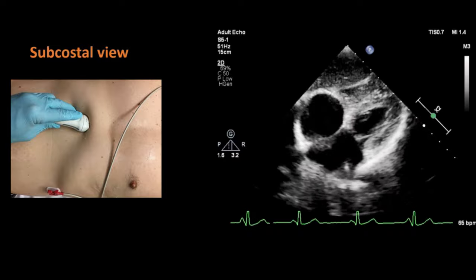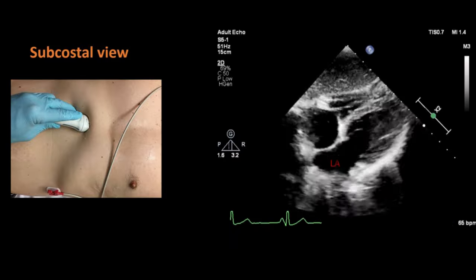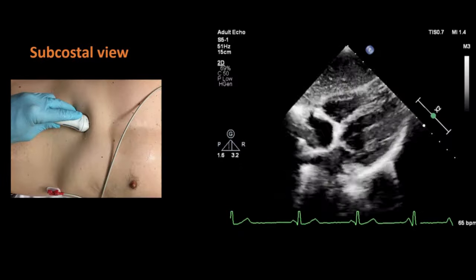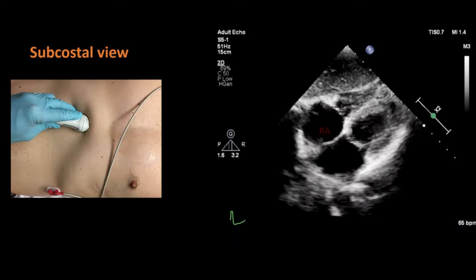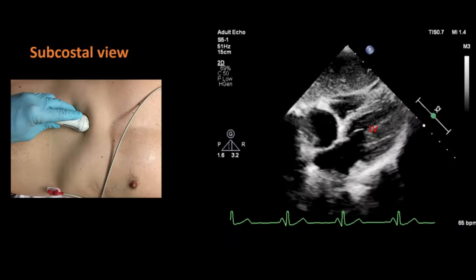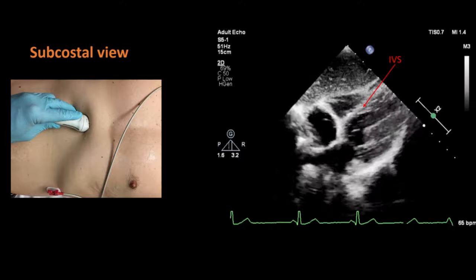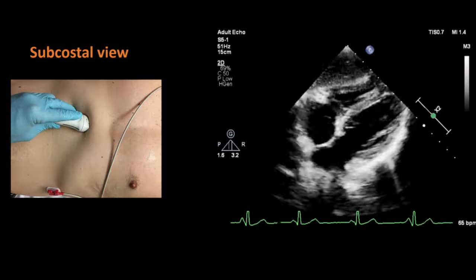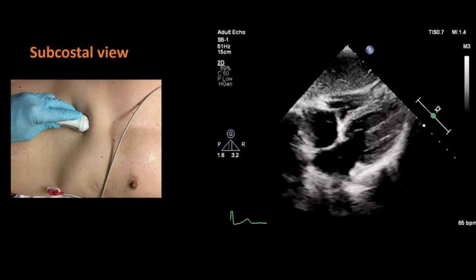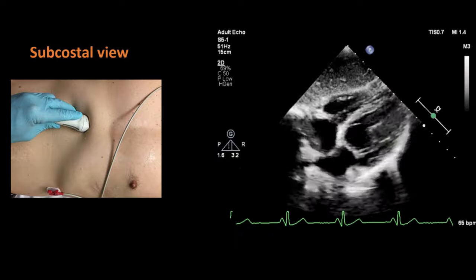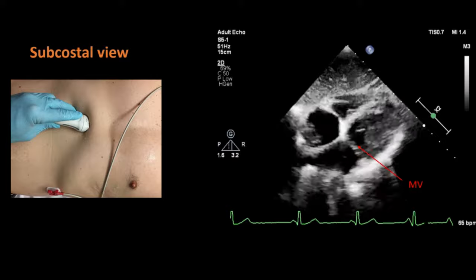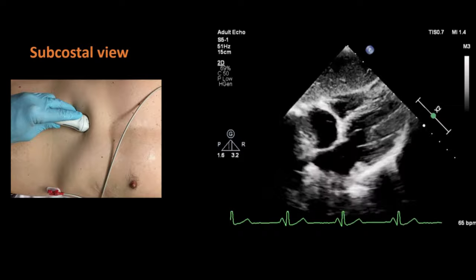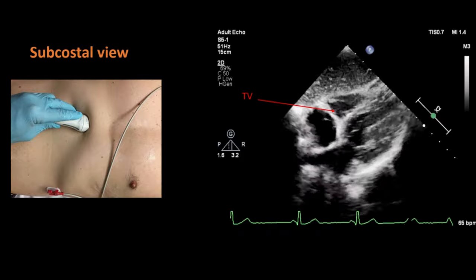In this subcostal view, you will be able to see the left atrium, inter-atrial septum, right atrium, left ventricle, and right ventricle. You can also see the two atrioventricular valves, which are the mitral and tricuspid valves. The mitral valve is located between the left atrium and left ventricle, whereas the tricuspid valve is located between the right atrium and right ventricle.